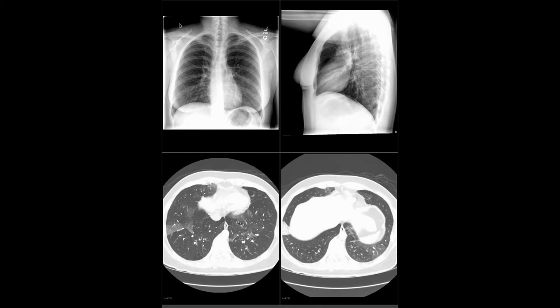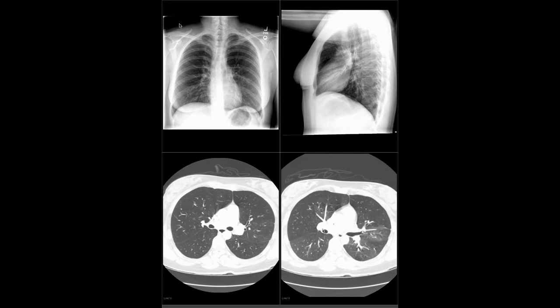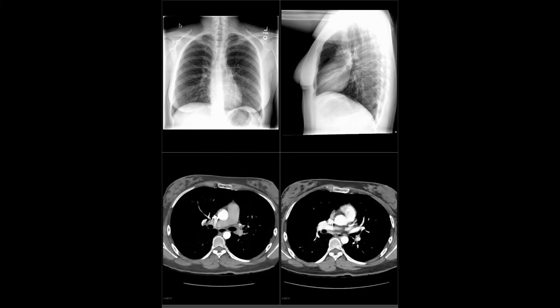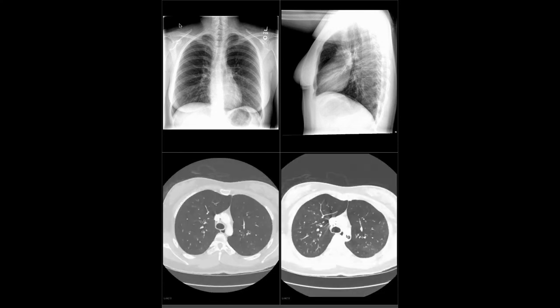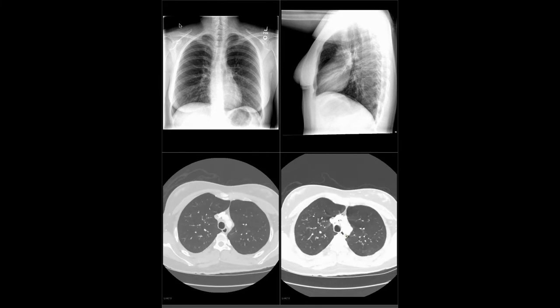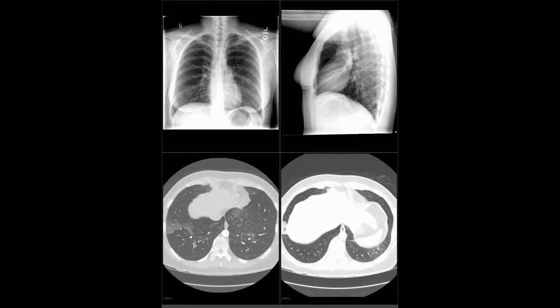Here's the CT, and interestingly, there was a PE study. They obtained it twice. I guess they weren't happy with the first bolus, and so we get the advantage of seeing the same pathology with two slightly different inspiratory efforts. It's probably inspiratory for both exams, but you can see that the trachea is perhaps a little bit larger on the bottom left image.